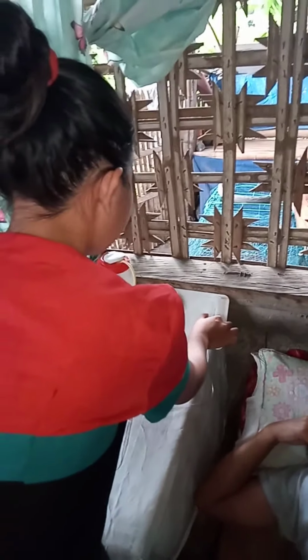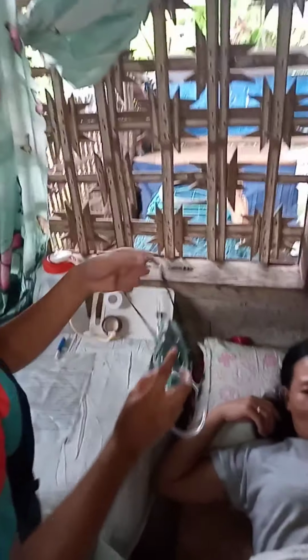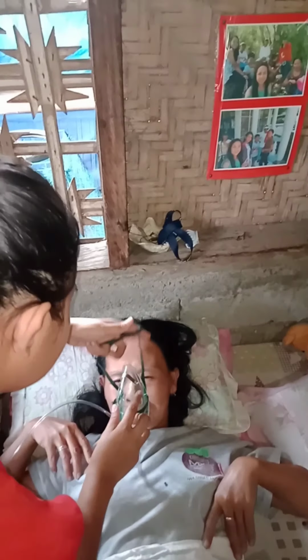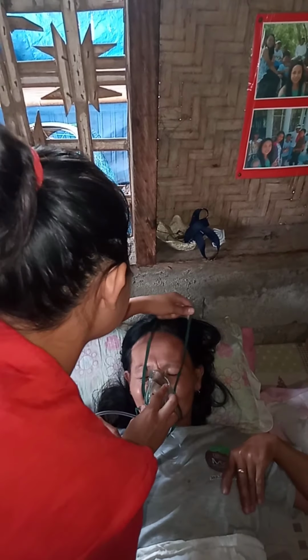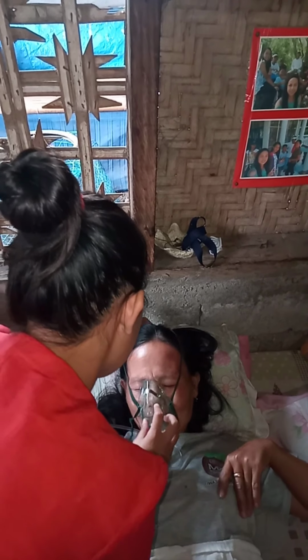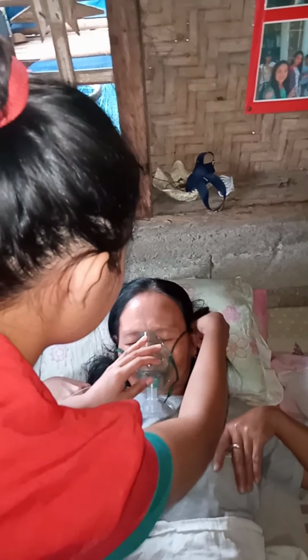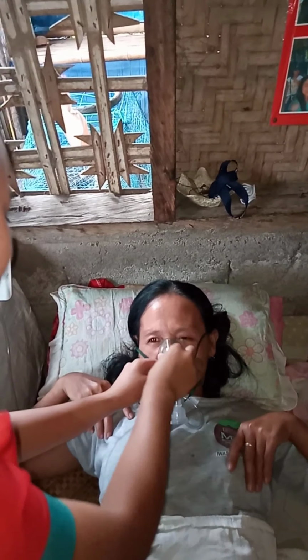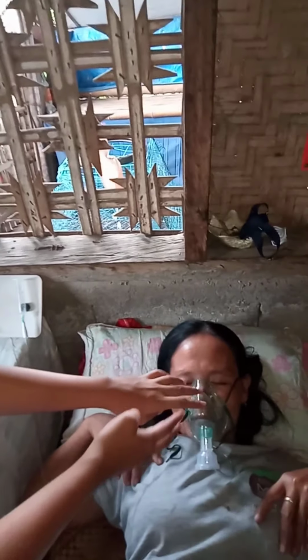Then turn on the prescribed flow rate. Then attach this face mask to the patient's face. Then place this strap under the patient's head. Make sure to slightly pinch the nose to secure a good seal of the face mask.